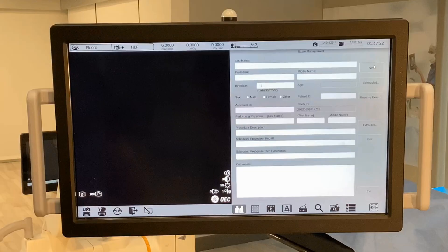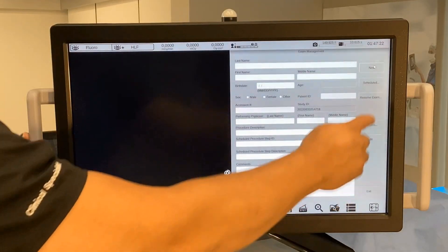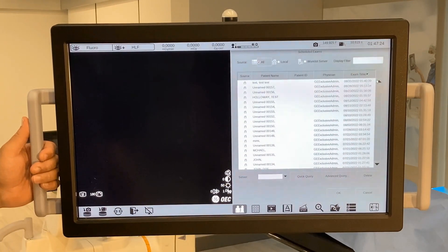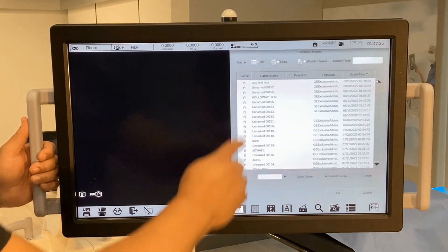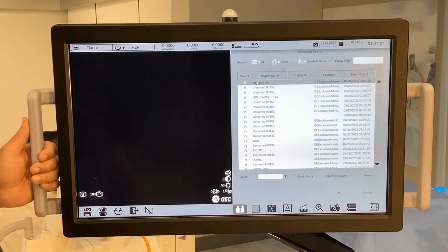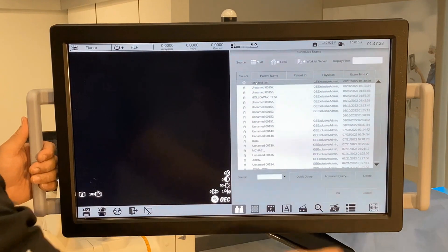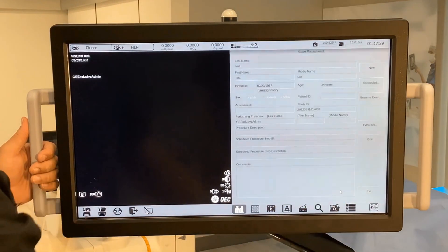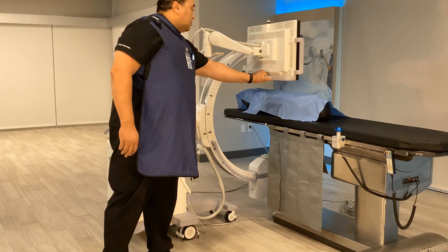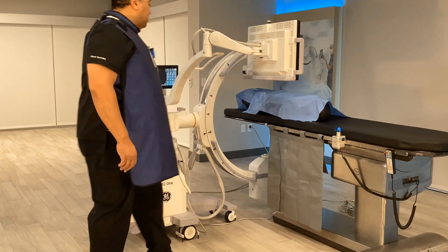To access a work list, press the scheduled button. Select the desired patient. If not seen, utilize the quick query button to refresh. Select OK. Move the monitor back to optimal viewing position.